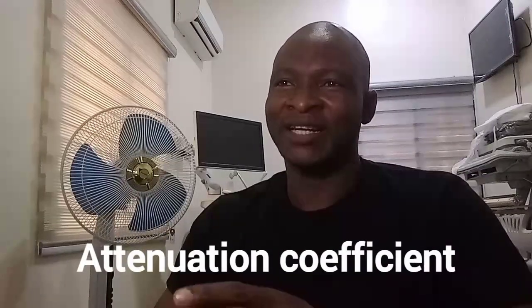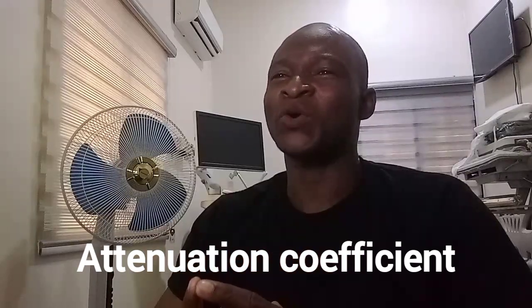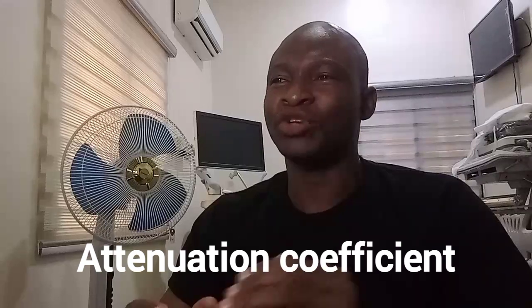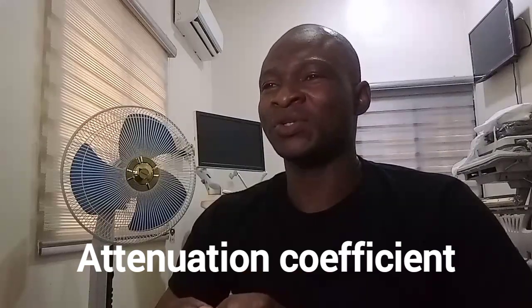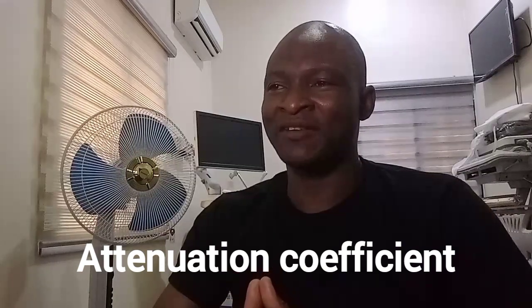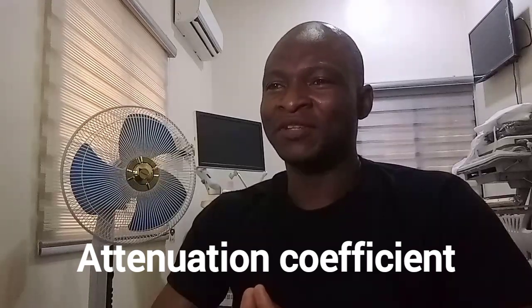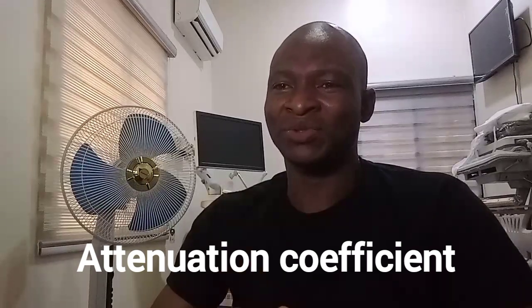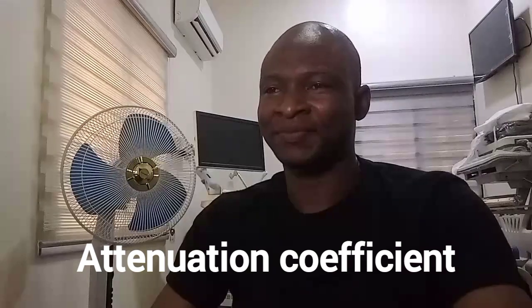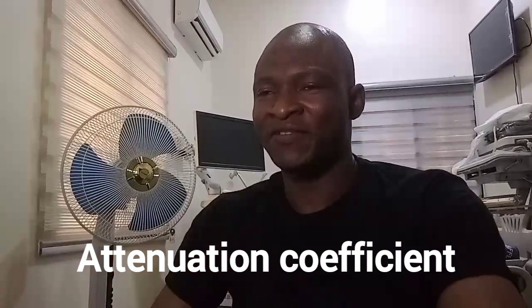Now, there's such thing as attenuation coefficient, and it is the rate of attenuation. The amount of attenuation that occurs per centimeter as the sound travels through the medium is called attenuation coefficient. Greater the distance of travel, the greater the amount of attenuation. Unit for attenuation is decibels per centimeter. That is, unit for attenuation coefficient is decibels per centimeter.